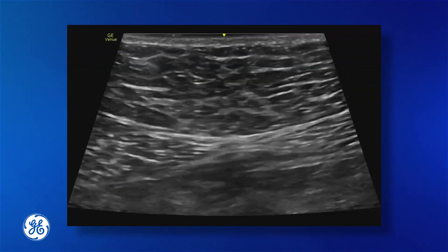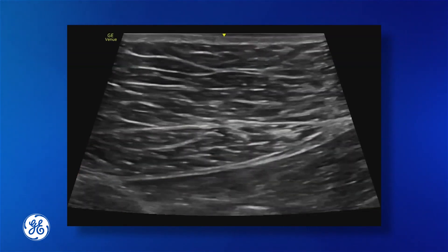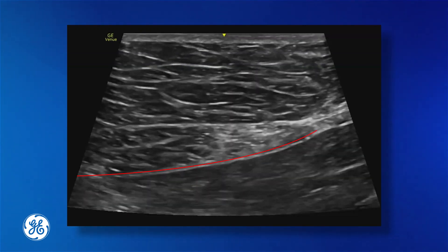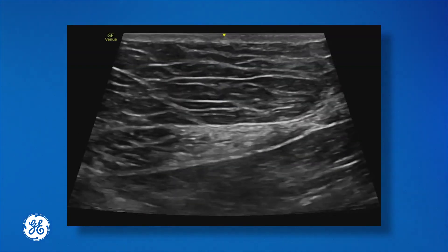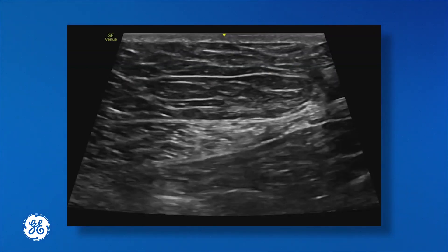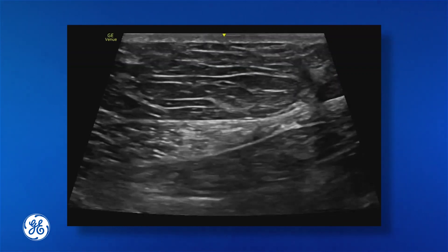We can look at this block in two different views: the transverse view and the paramedian view. Taking one rectus muscle, we can see the anterior fascia above the rectus muscle, the posterior fascia below the muscle, and the peritoneum and transversalis fascia sitting below the posterior fascia. Unlike most fascial plane blocks where we inject between fascial planes, the rectus sheath block is different — we want to inject above the posterior fascia.